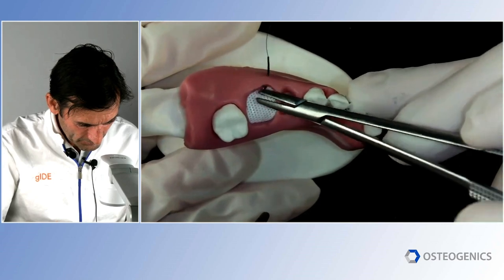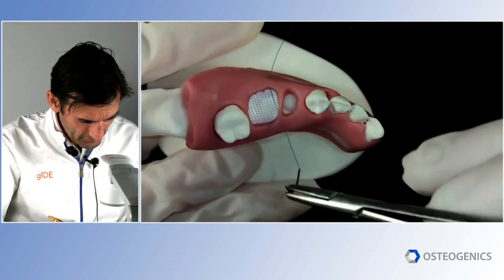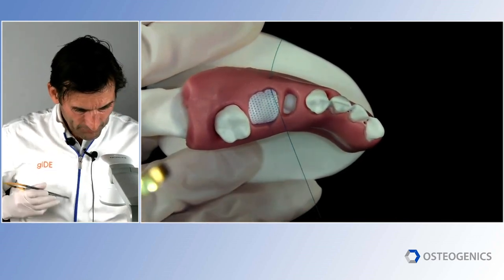Then I go over the membrane. So the suture is now going over the membrane. I pull it.